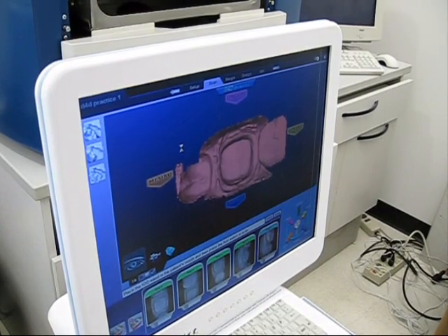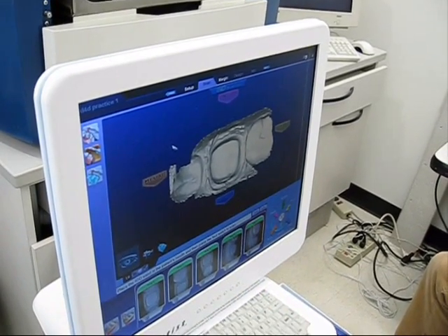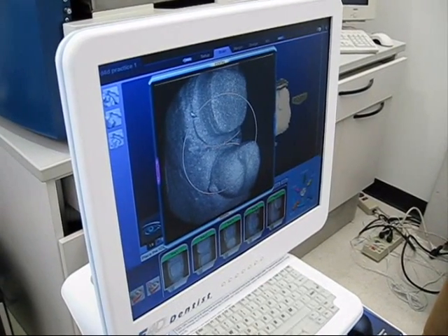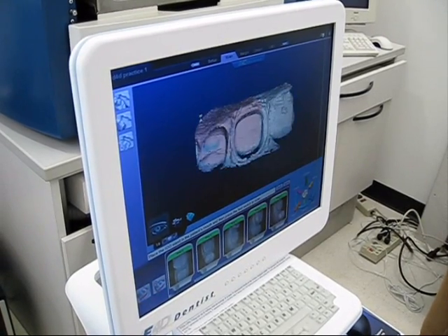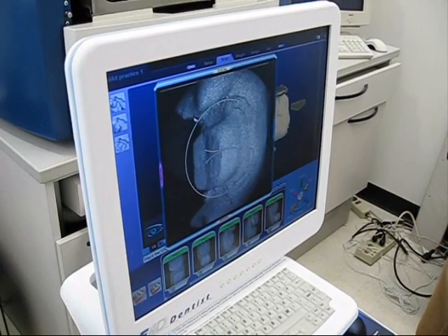And everything's cool as long as they stay green, correct? Right. These green tabs here indicate that the alignment was satisfactory. The software believes it's a good image. I'll show you what happens if it's way off. You'll either get a yellow image or a red image. If it's a red image, the software will throw away that information from that scan.